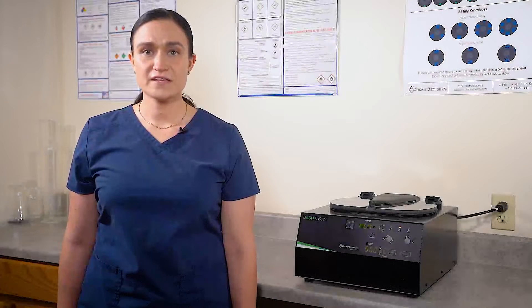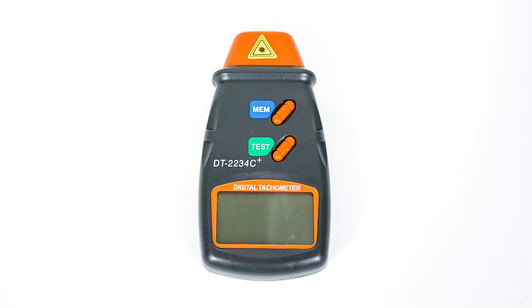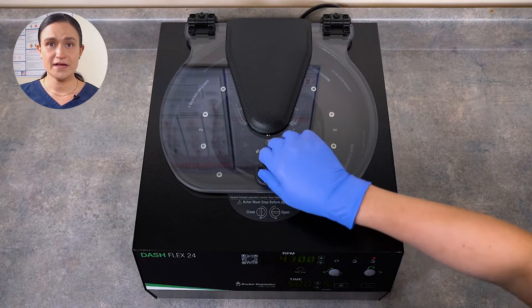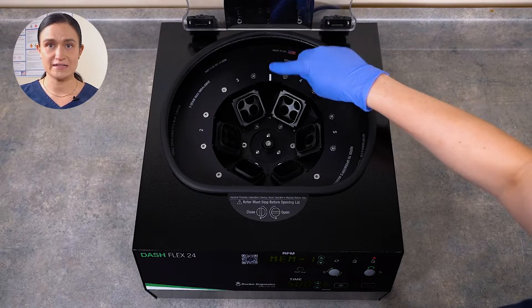Your DashFlex 24 does not require any regular maintenance, but you may wish to confirm the spin speed. To do that you'll need a photo tachometer like the one shown here. Your rotor has a reflective strip on it so the photo tachometer can easily detect the speed.